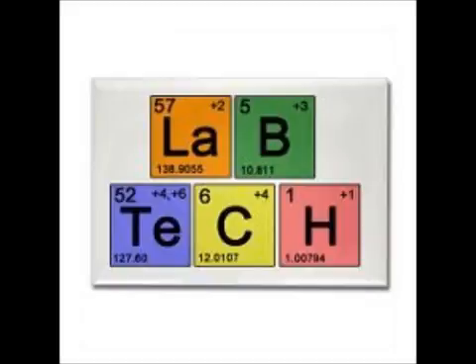So I hope some of you, I think this would be a really interesting one to see for coag. Yes? When you use serotonin as a control, you know what's going to happen. I don't really know what they use serotonin for, but to me, I think it looks like what you would do if you can't aggregate. So I don't really see how you tell anything. If it goes back up to 10% and that's what you started, how would you know if it did anything with serotonin? That's why I don't have you know it, because without ever having done this test, I don't see the purpose of it. But the other ones, you can kind of see how you could tell a problem.